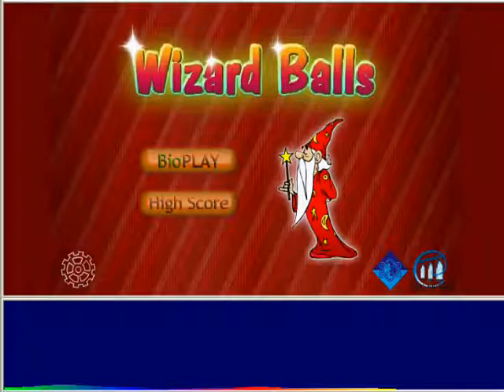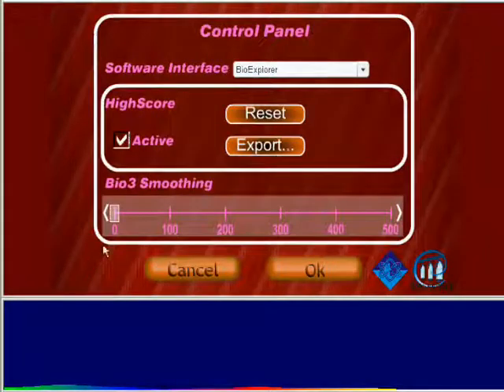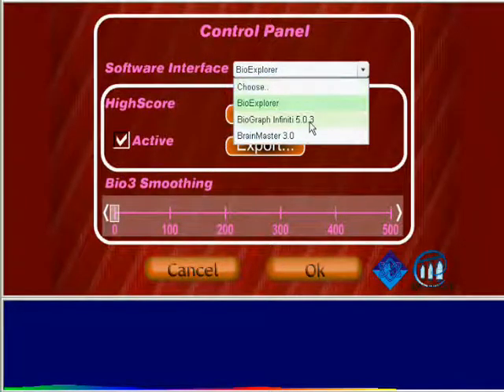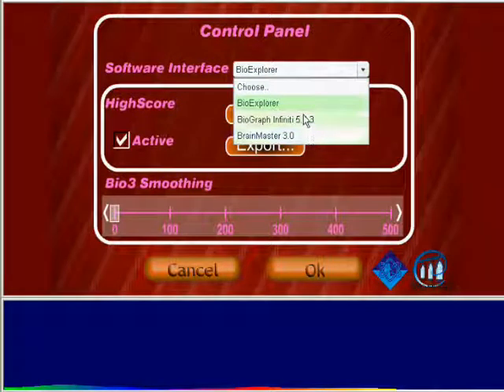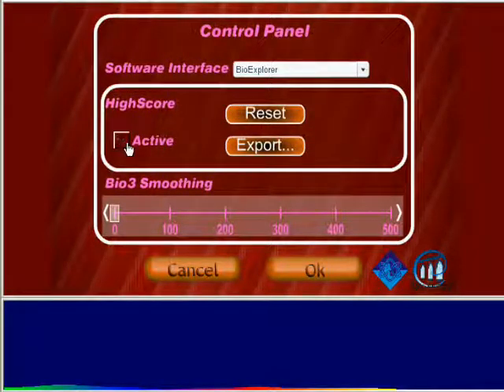To start with BioPlay, configure the control panel accessed through the cog icon at the lower left. Choose the software interface you're using. To disable high score tracking, uncheck the box.